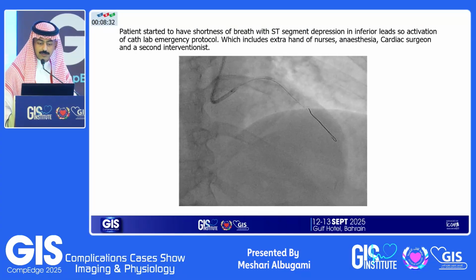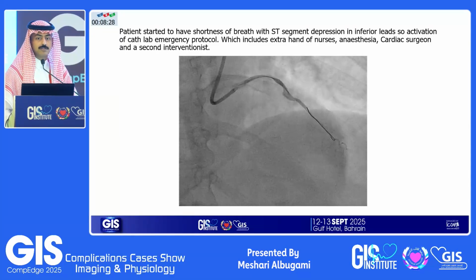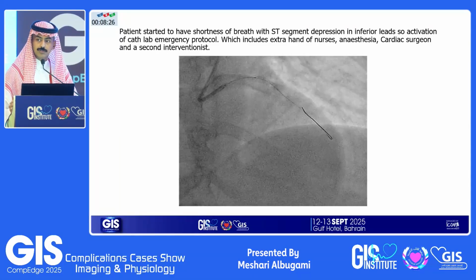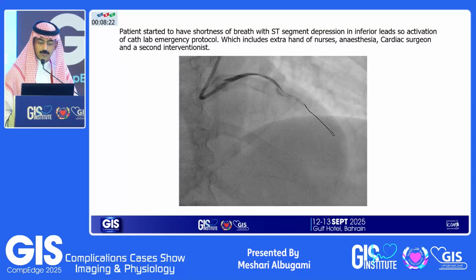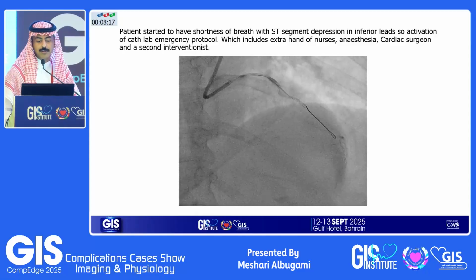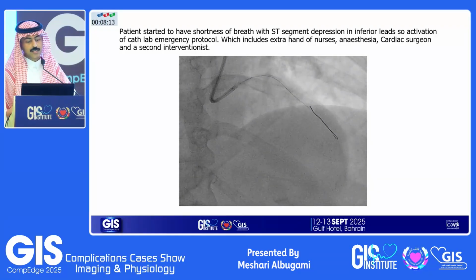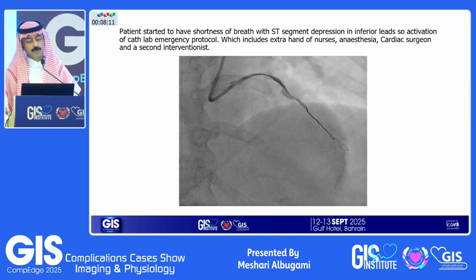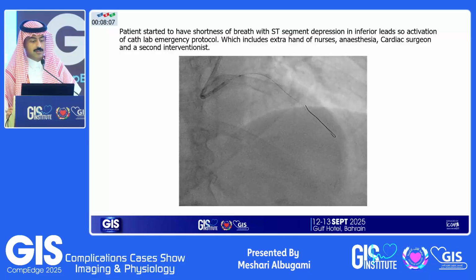My apologies, I don't have the first angio at the time of engagement. But at the time of engagement, due to the lack of coaxiality, there was a complete loss of flow to the LAD, which led to cath lab emergency protocol activation, which includes calling a second interventionist into the room, extra nursing staff, cardiac surgeon alert, and anesthesia.